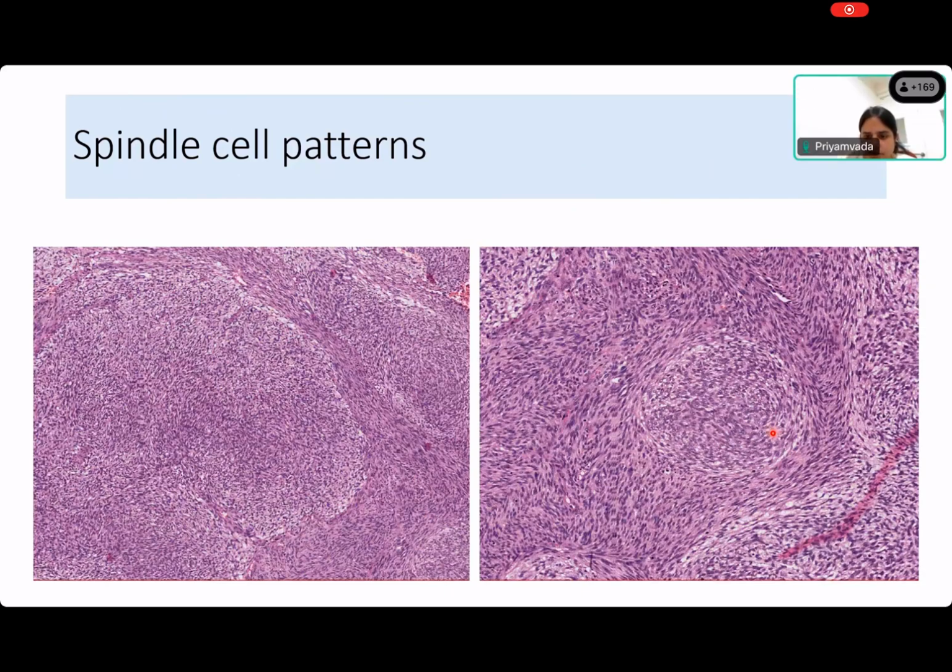Ma'am, it's like a whorl. Yes, it's a whorl, but it's not storiform, is it? No, ma'am. It's a combination of two patterns, ma'am. All right, what are the two patterns? In one area it is fascicular. Oh yes, you're seeing fascicles. Very good. And I can see the fascicle over here. Excellent. You can see the fascicle here, and we also see a fascicle here, a fascicle that is sort of running around.